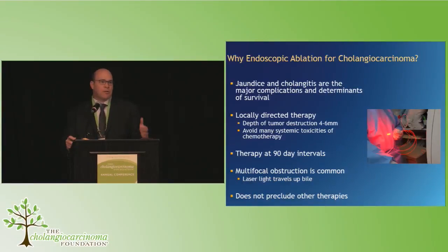The endoscopic therapies are locally directed therapies, so they're done inside of the bile ducts. And they're done typically at 90-day intervals is how it's done in some centers. Others will have different approaches. But the way we approach it is at 90-day interval treatment. So patients will come, have a treatment, and then don't have another treatment. And if they choose this as sole therapy, don't have to see doctors again for 90 days.